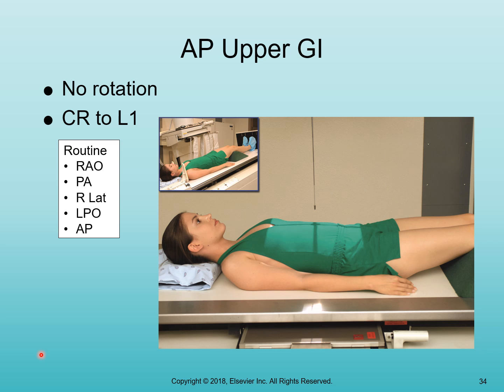Okay, 110 at 2 for single, 90 at 2 for double or water soluble. That's what your control panel would be set at. You're at a 40-inch SID. Patient is lying on the table relatively straight and in the middle.